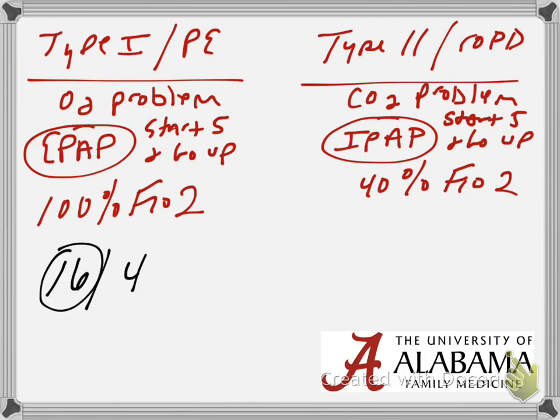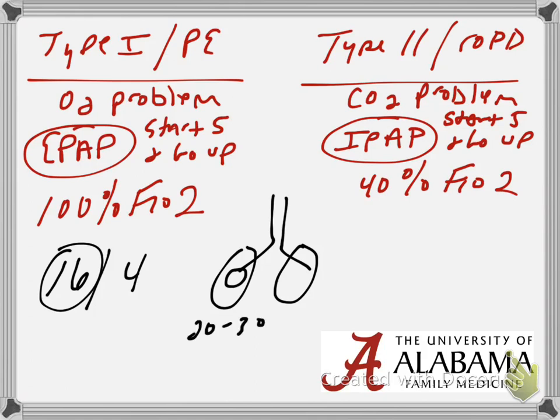Well, the 16, if you remember, these are poor pictures of lungs, as we breathe in, the plateau pressure that the alveoli actually see, we want between 20 and 30. So when you intubate somebody and you pick a generic tidal volume of 500, you look and see what the plateau pressure is, because that's actually what the alveoli see.